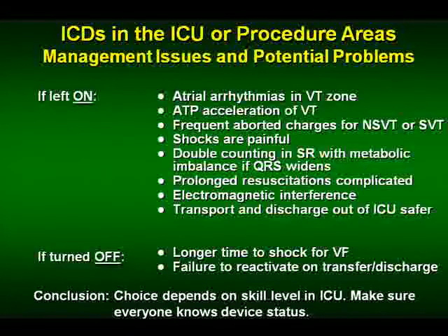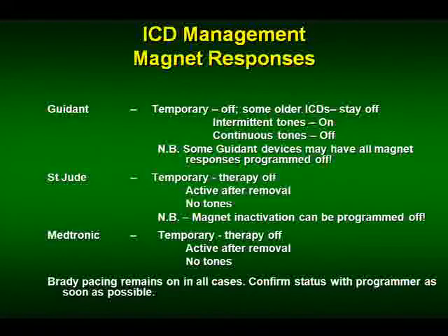So you really have to know what's my skill level, how much help is available, and you really have to know what the device status is. Now, a lot of people will say, well, I can put magnets on, and magnets are helpful. The problem is that magnets can do a lot of things to defibrillators. When they're on, they inactivate sensing, and they always inactivate tachycardia functions unless you've happened to program that off. And you don't know that unless you have a programmer.